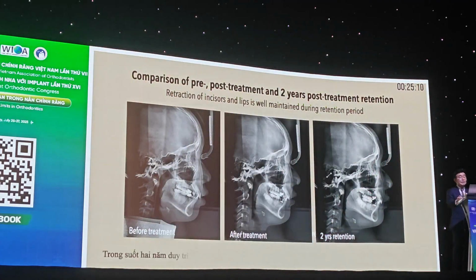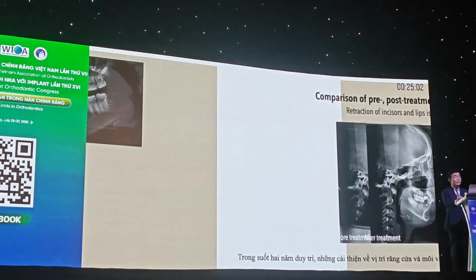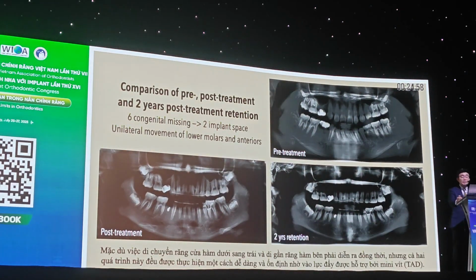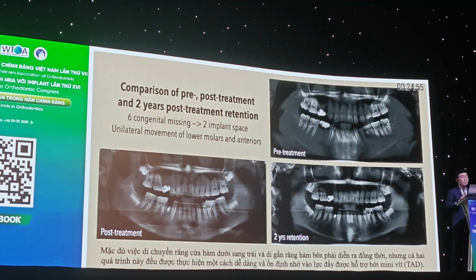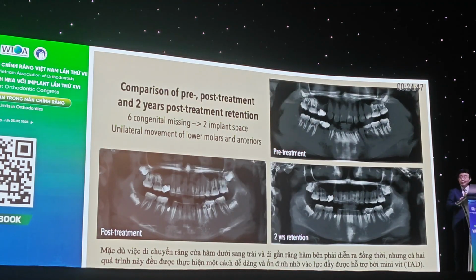Throughout our 2-year retention period, the improvement of the incisors and lips has been consistent and well maintained. Although the leftward movement of the mandibular incisors and forward advancement of the right molars occurred simultaneously, they were achieved with ease and stably through the utilization of TAD-supported pushing force.